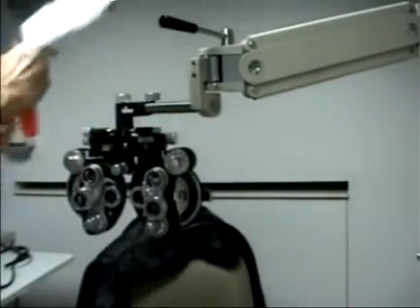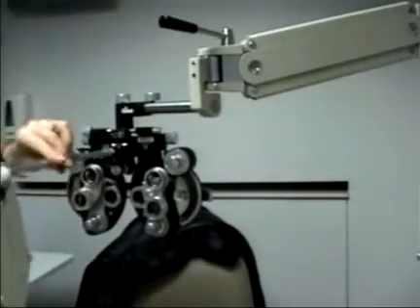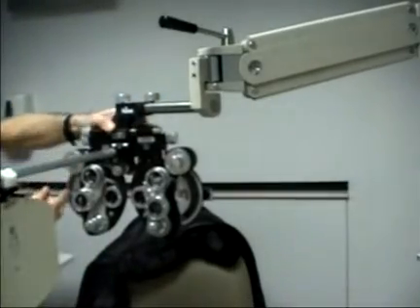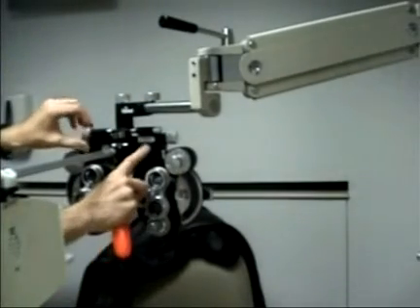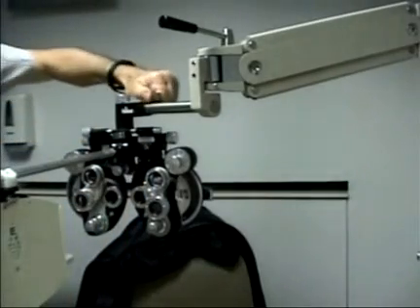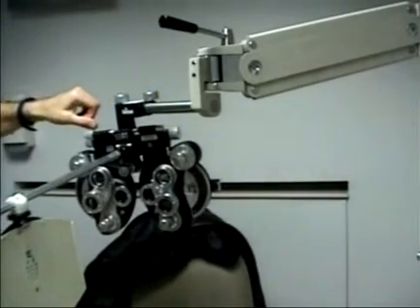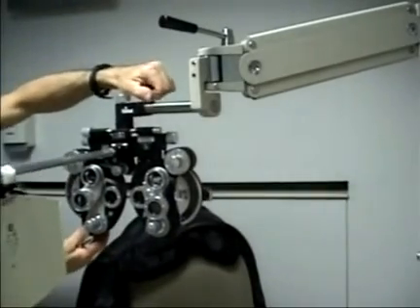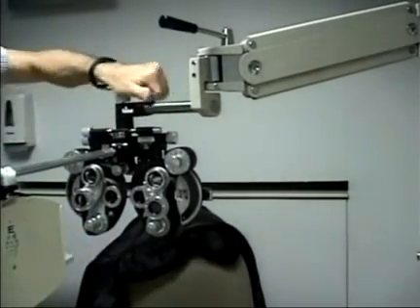To line up the phoropter in place, the near-point rod is helpful. Get the near-point rod level with respect to the floor or wall features, and then use this knob to level the bubble. If this knob is loosened, the phoropter tilts out of orientation. So loosen the knob, level it with the near-point rod, and then tighten the knob and level the bubble.